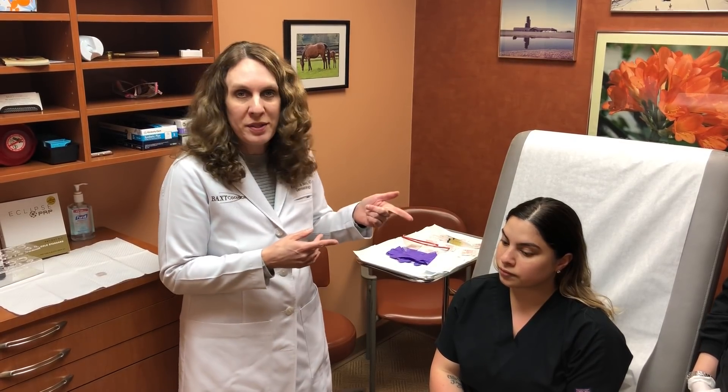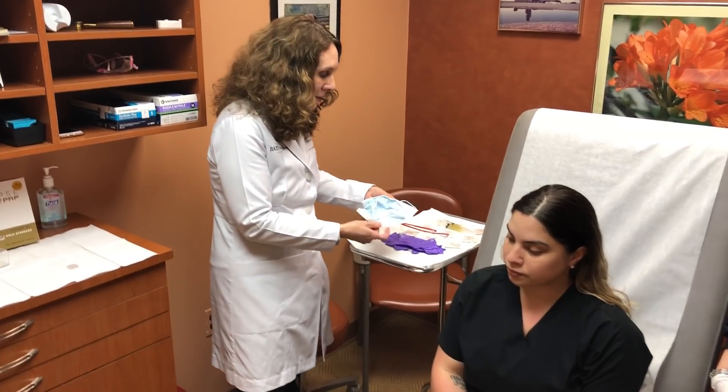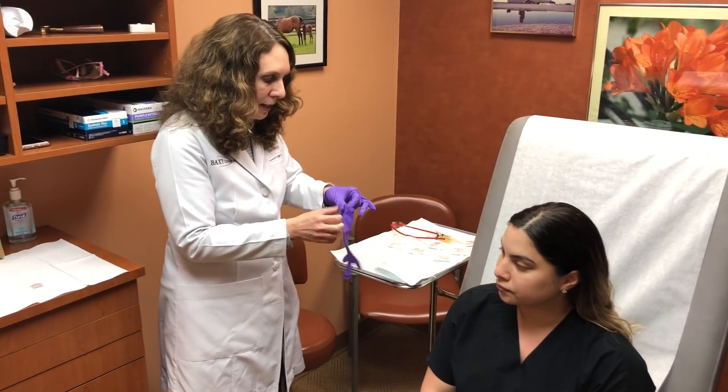We'd be happy to see you in consultation if you'd like to come in and discuss it to see if it's right for you. We do have a lot of success with it. I'm going to start doing a treatment now, right now, on the scalp. It's a blood product, so we put on a mask and goggles.